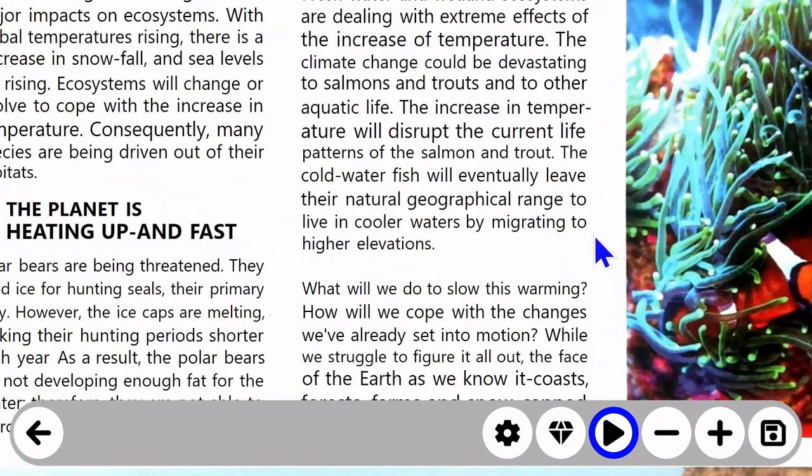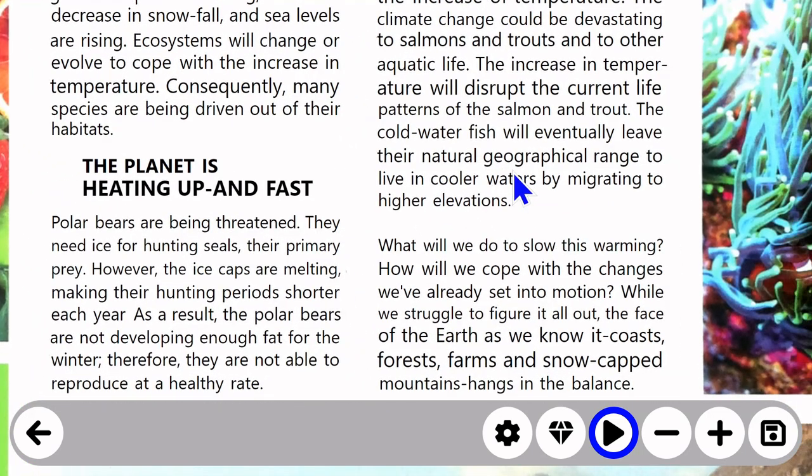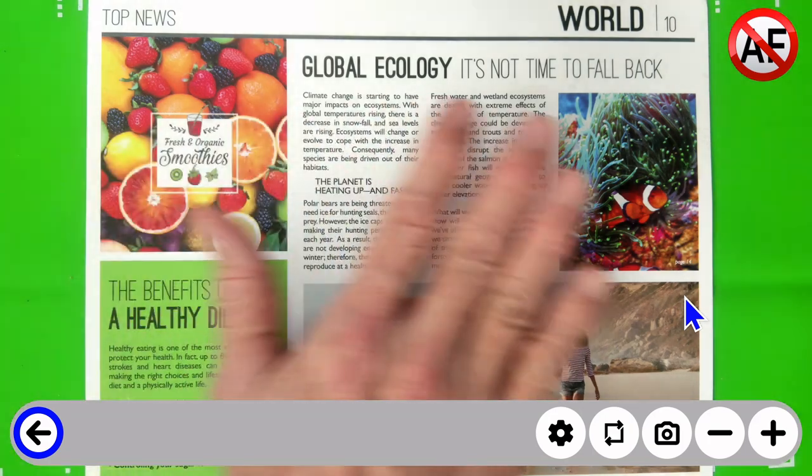And again, I'm using the wheel right now. I could be using my plus and minus over here. So we've covered all of the settings that are available to us with a captured document. And in this case, it's a single page that we've captured. Let's click on this little disc-shaped icon to the far lower right corner of the screen. It will save that document to our Files application, and now we're back in our live view.